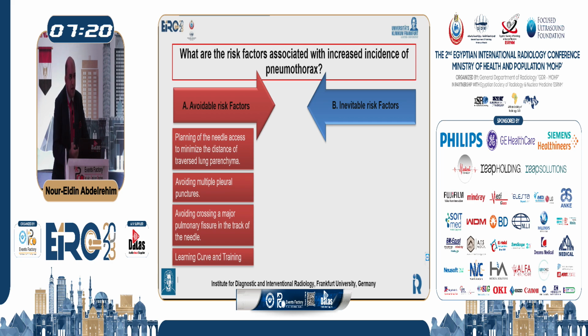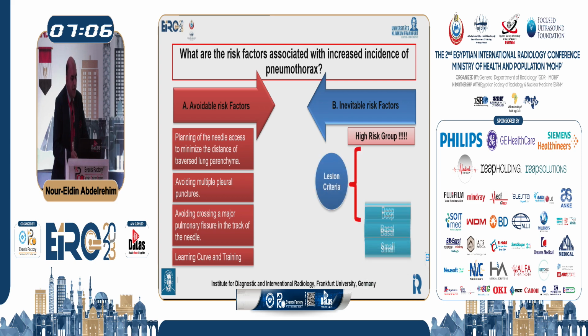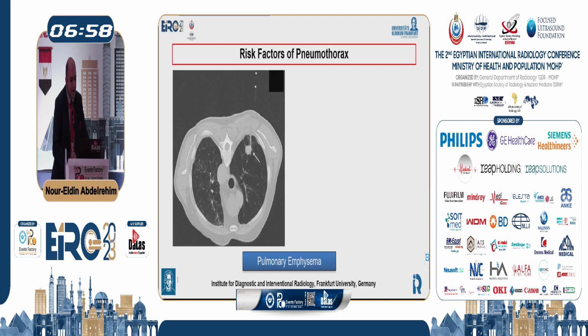and also increasing or improving the learning curve of your technique. You will refine your skills and will minimize the risk of complications. Inevitable risk factors, or the high-risk group, are lesion criteria like deep, basal, or small lesions. They are highly associated with the risk of pneumothorax, and so are COPD and emphysema. I will show you some cases that were associated with pneumothorax.